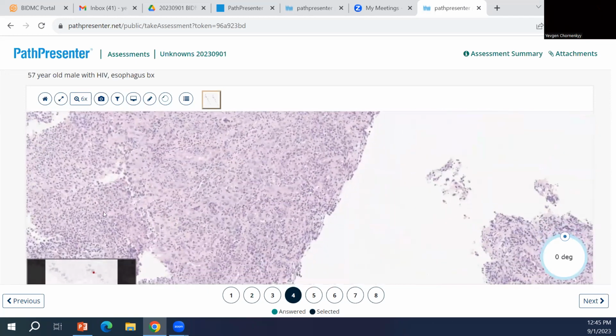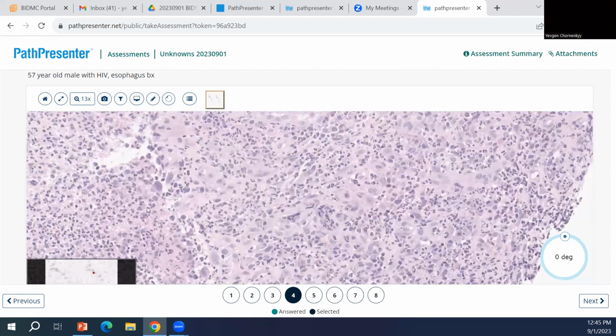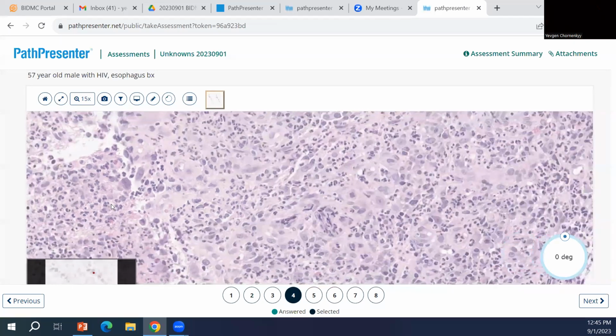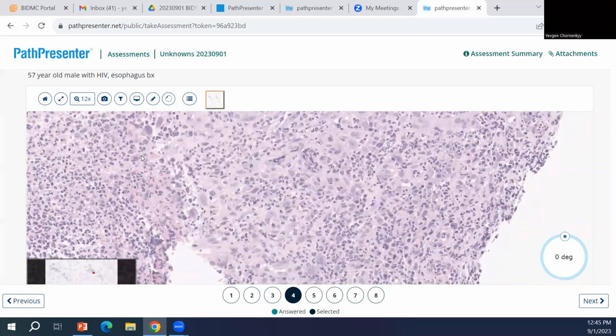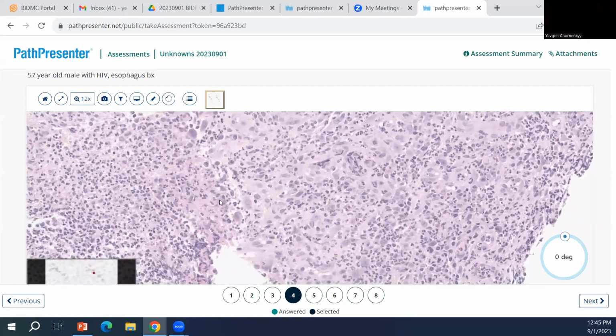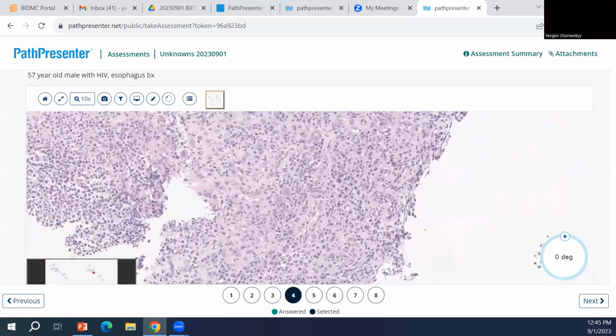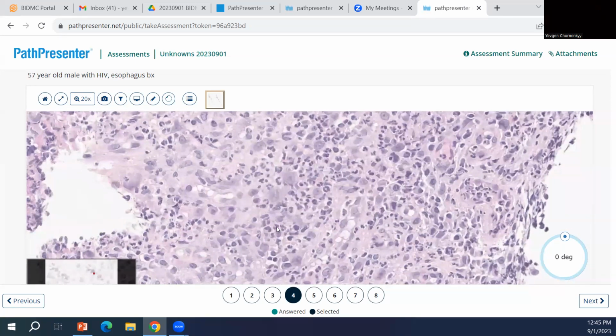Yeah, often we'll throw a keratin stain just to make sure, but my guess is it's probably just reactive. What's interesting is that I don't see very much cytoplasmic inclusions. We're just seeing nuclear inclusions. Generally, you always see some cytoplasmic, those reddish little dots.